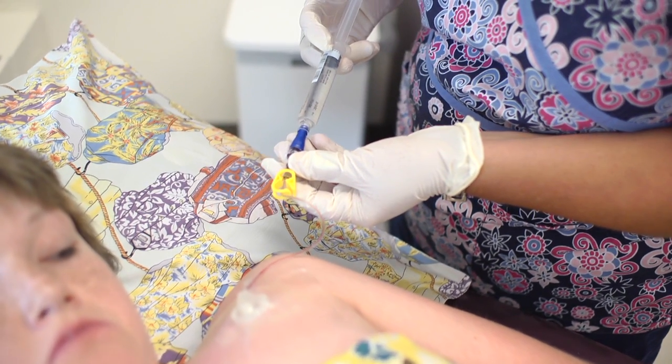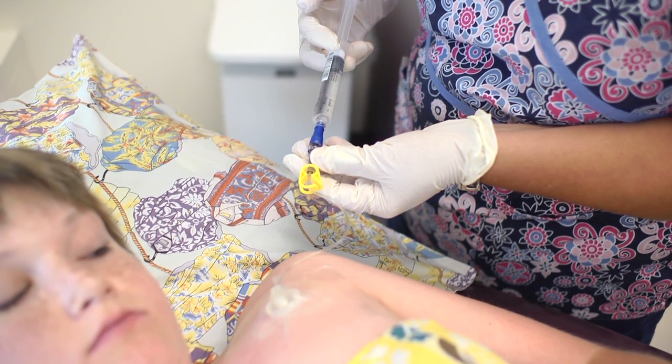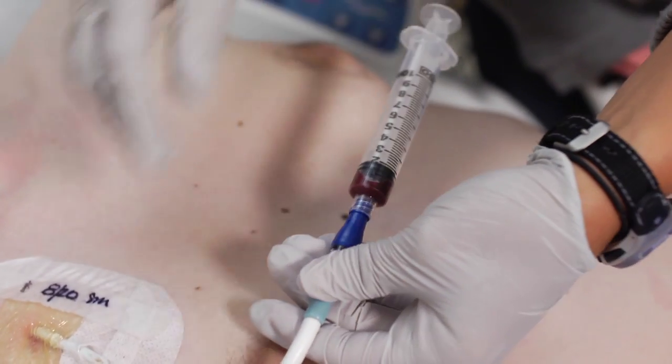To draw blood off a line, first it is flushed with saline. After flushing, the nurse will draw back and waste some of the blood they withdraw from your line. This removes all the blood in the line that is diluted with saline that was just flushed in, which will make sure that the lab results are accurate. After pulling off a waste, the sample is removed from the line. The line will be cleaned with an alcohol pad and then flushed with normal saline.